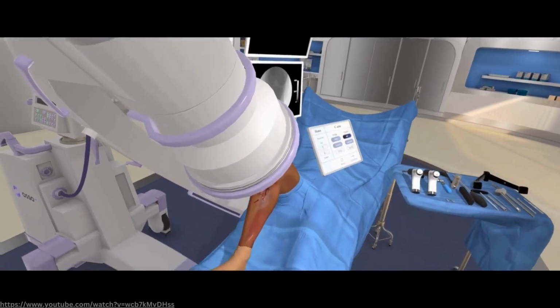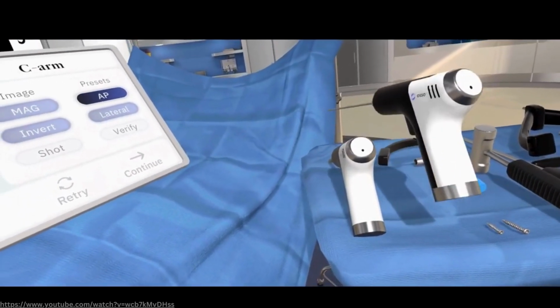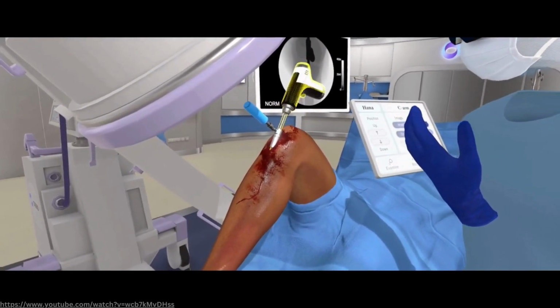As you can see here, with the help of a VR headset, the trainee surgeon enters the surgery room. With the help of controllers, the trainee mimics surgical equipment and tools and gets haptic feedback when interacting with the virtually simulated model.